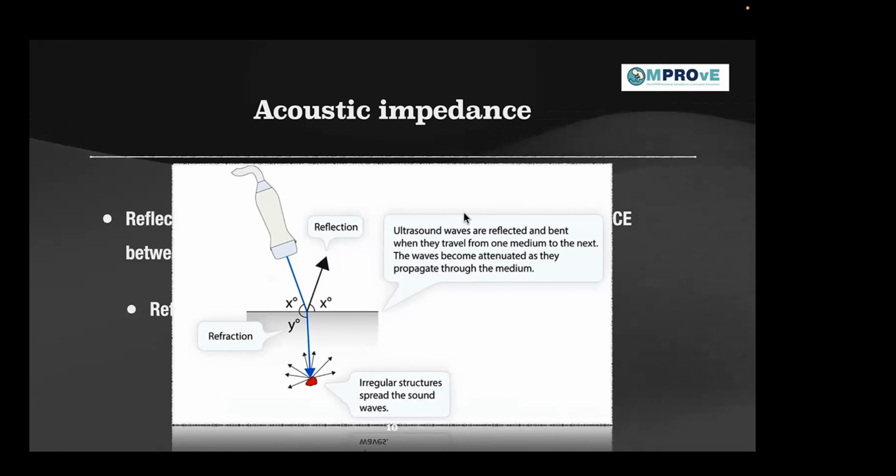This image, the schematic, will explain it better. So when ultrasound waves are hitting a particular structure, for our sake, let's say this is a pleural line, it's going to hit and then reflect. So these are your reflected waves, which will be interpreted by the scanner as having a very high impedance, say 90% of your waves are reflected back. So it's going to give you a bright image. As you can see, the pleural lines are very bright and discrete.